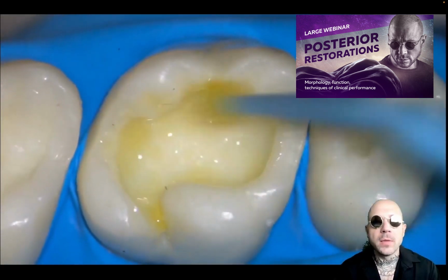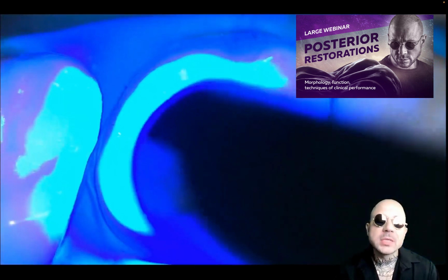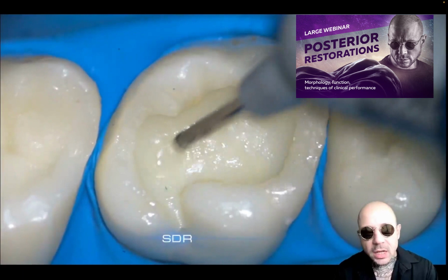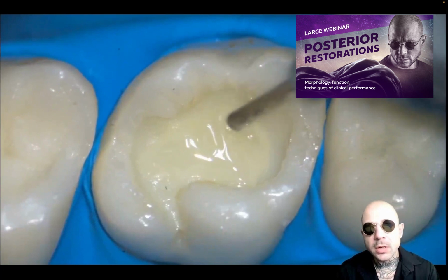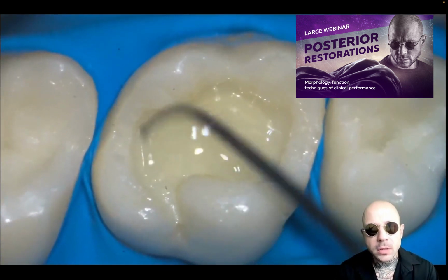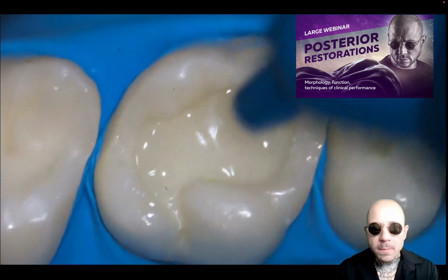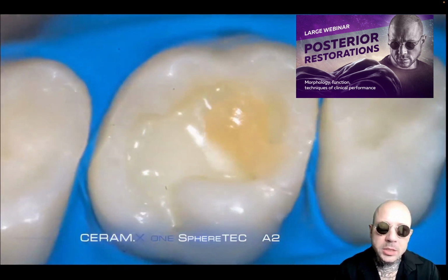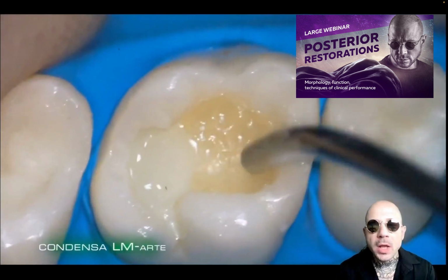Restoration of first maxillary molar with a cavity of not extremely big size. Application of the adhesive system, and then SDR, some portion of bulk fill in there. Spreading with fissura. Then, as the first layer, as you can see, in this case I used SphereTech Ceramics SphereTech A2.